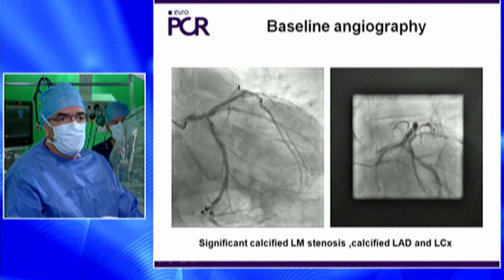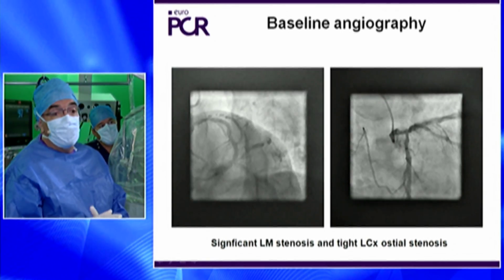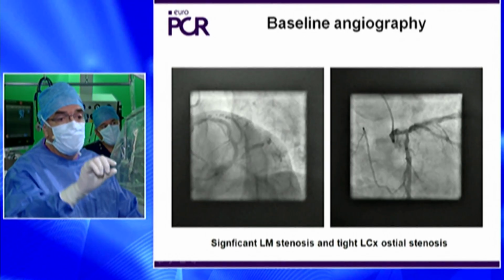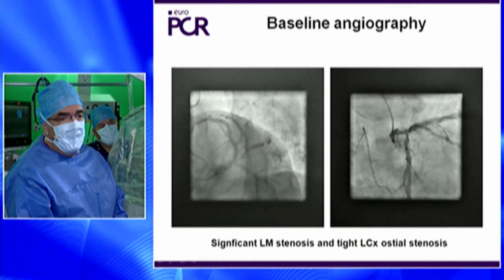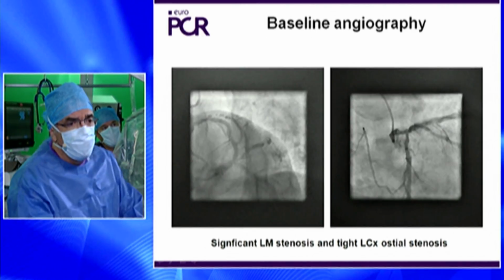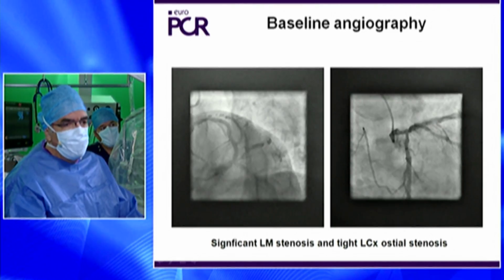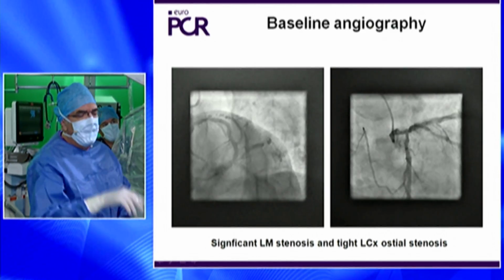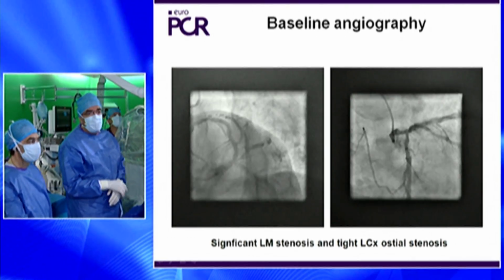The goal today will be to treat the left main, the trunk, the bifurcation, the proximal LAD, and certainly we will place a stent in the ostium of the circumflex artery. But we decided at the beginning with Giulio to leave the intermediate branch. It's a risk that we take for the patient, but I think it would be too complex if we try to treat all the trifurcation.